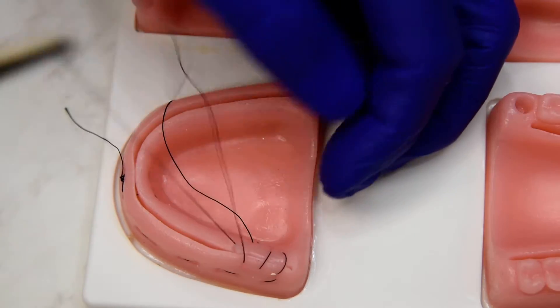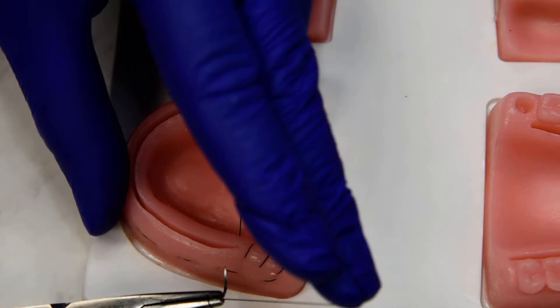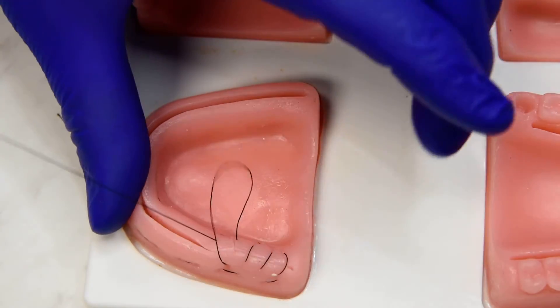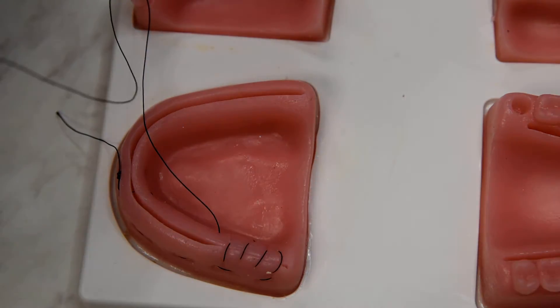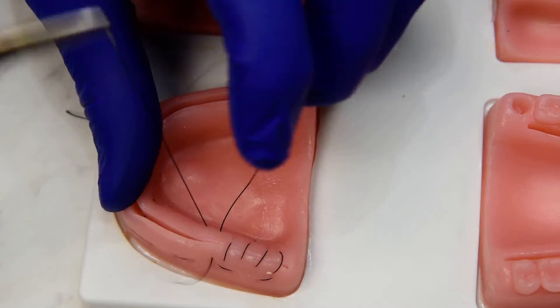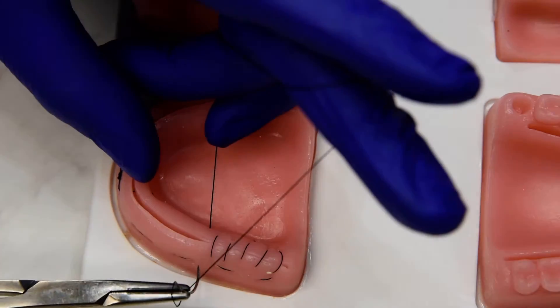So you get the benefit of the mattresses everting the tissue, approximating the tissue, and relieving the tension. And then you get the continuous for the incision closure and the watertight closure along the top of the ridge of the incision line.